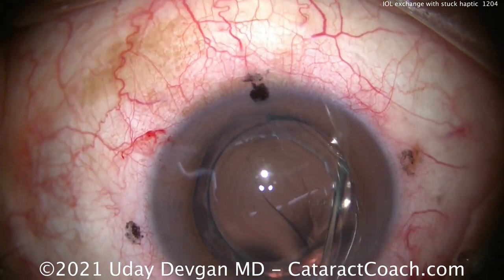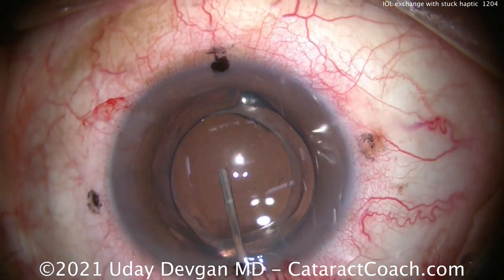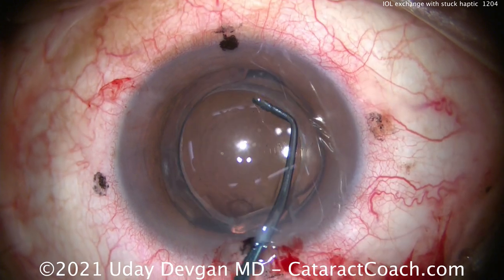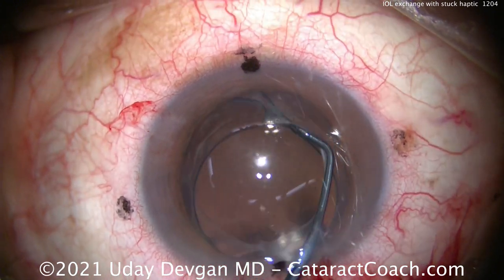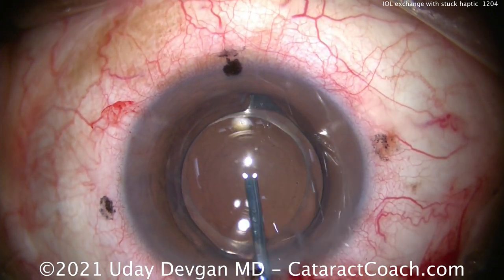Now injecting more viscoelastic — watch behind the optic. That's a viscoelastic wave. That wave of viscoelastic has dissected the optic away from that delicate posterior capsule. Can we pull out one haptic? Let's free it up more.